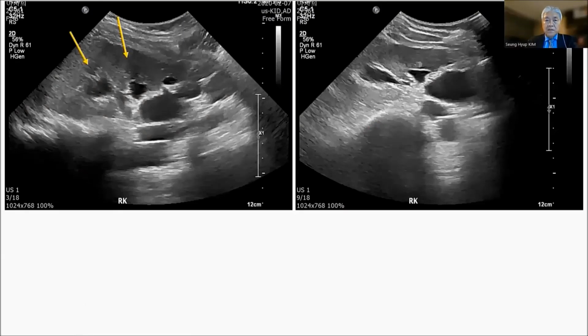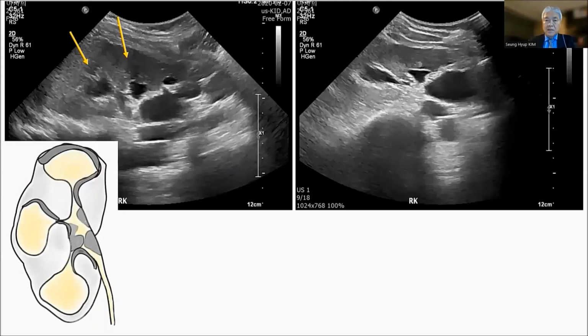If we see these cystic structures and the hypoechoic medulla, but dilated calyces are not connected to each other, and the degree of dilatation is uneven, with lower polar calyx more dilated, and the renal pelvis is not dilated but contracted. Considering all these findings, we may have an impression that this kidney probably looks like this schema, and we may make a diagnosis of renal tuberculosis.